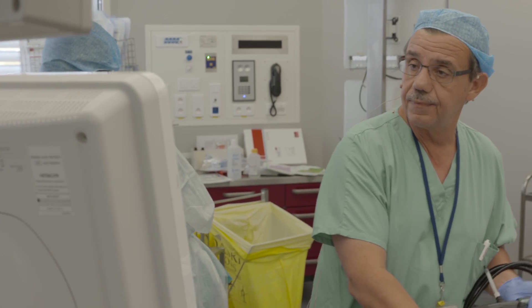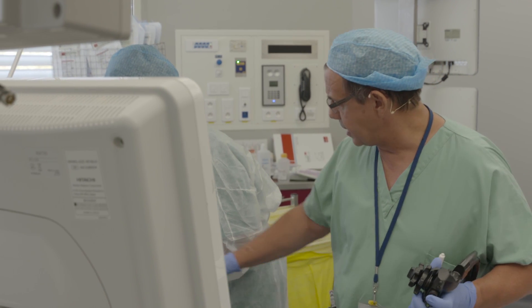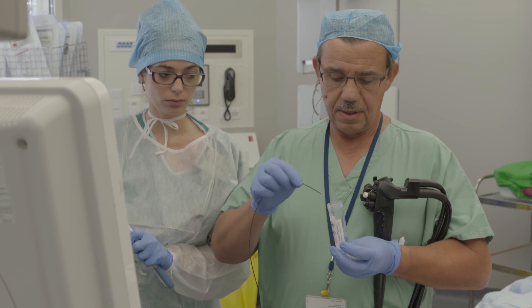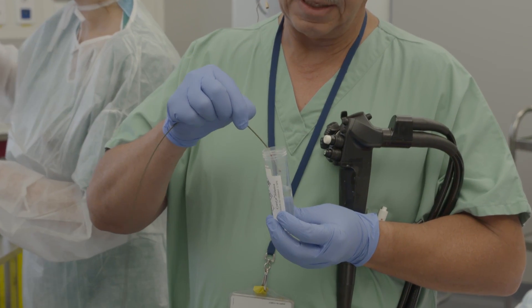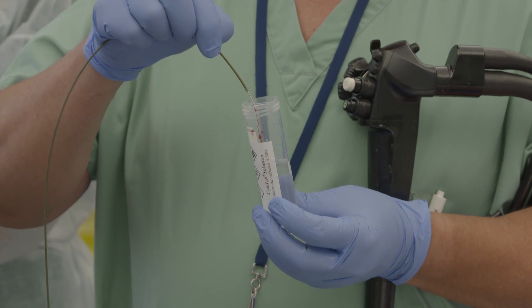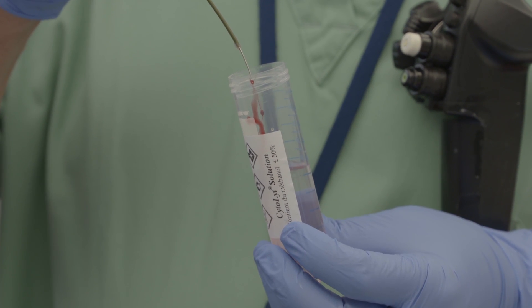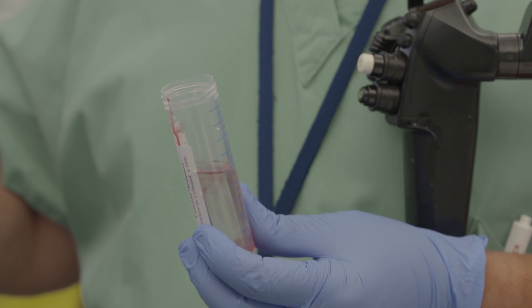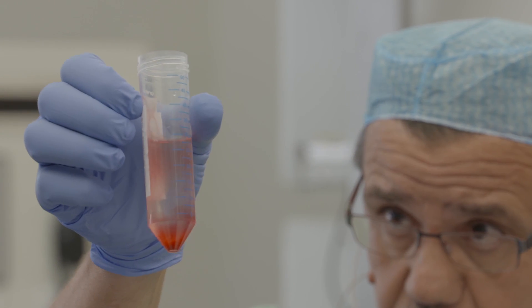Now I remove the scope. We will see the results. I think we have a nice result with a microcore. I think this will be enough for the diagnostic of this lesion. We have enough tissue here to conclude for this case.